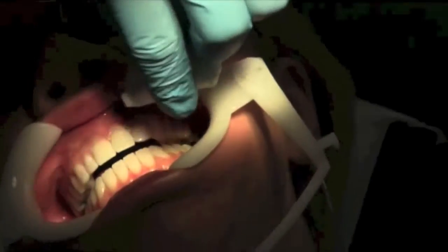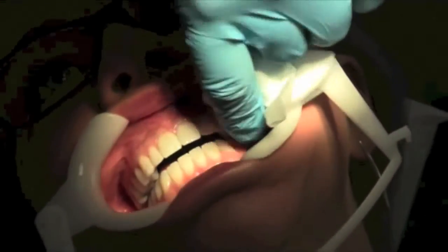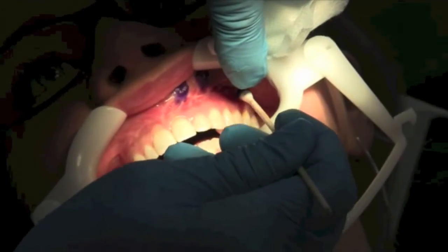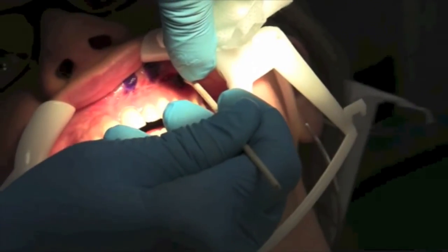Once again, you would dry, retract, and place the topical into the buccal fold between the 4 and the 5.